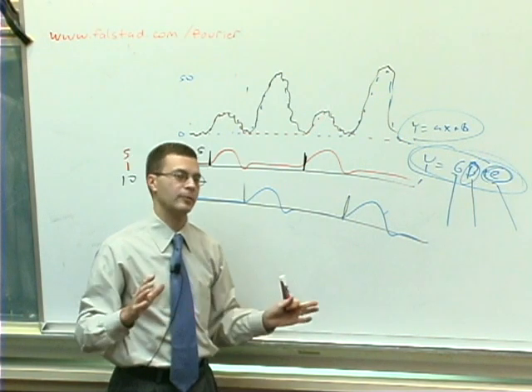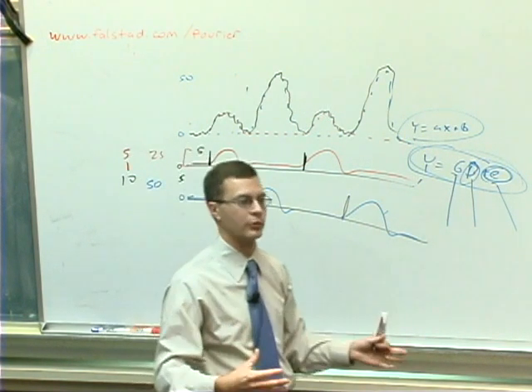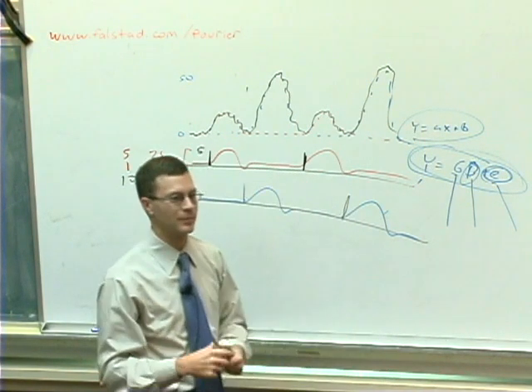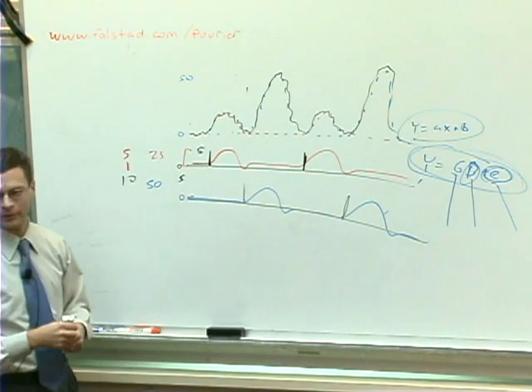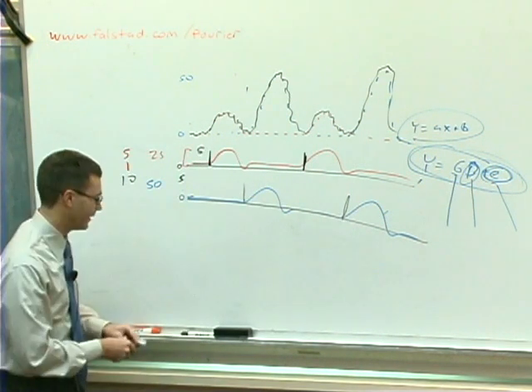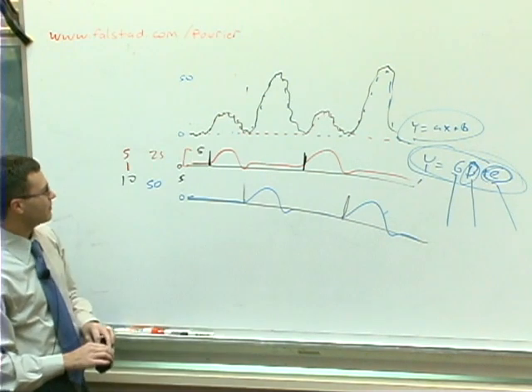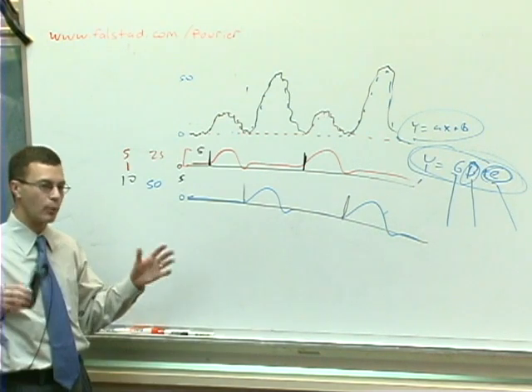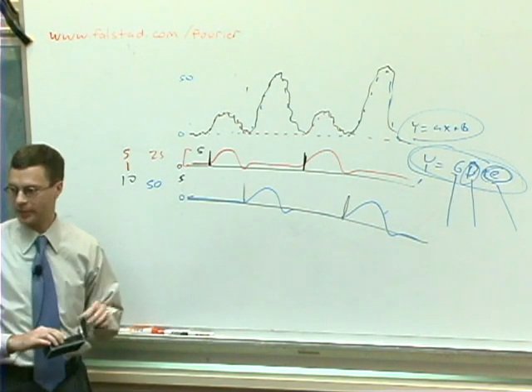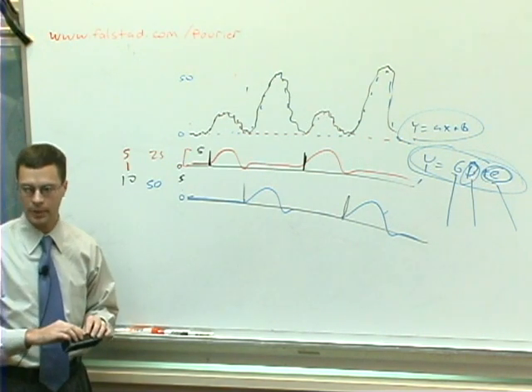Well, that was a gross oversimplification. The t statistic is proportional to beta divided by e. But it's a lot more than that. So just again to try and provide you with the intuition. And I promised I was only ever going to put one equation up on the board. So I've used up my one equation. Sorry. But the important thing is to understand where these covariates come from and how they're related ultimately to statistical values. Okay. All right.